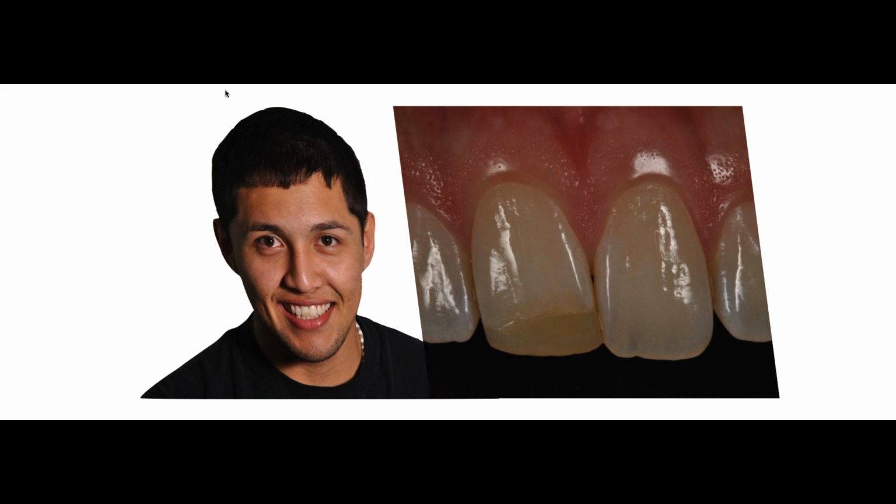So the question at this point is that if I want to do a multi-chromatic restoration and I don't have this kind of information, how in the world should I expect to achieve a good result? It's impossible. This is why I like to do dental photography, because with this patient and with many other patients that I see in my practice, this is what I do. I sit down and I look at their photos before I even reschedule them to actually do the restoration.